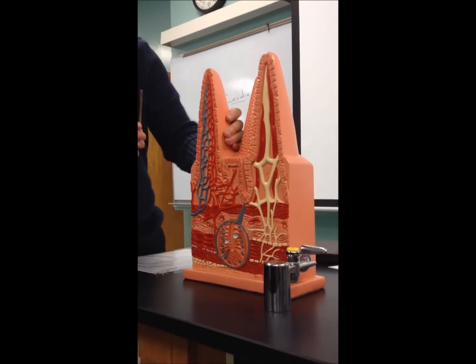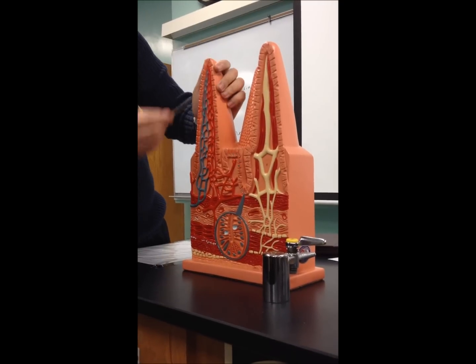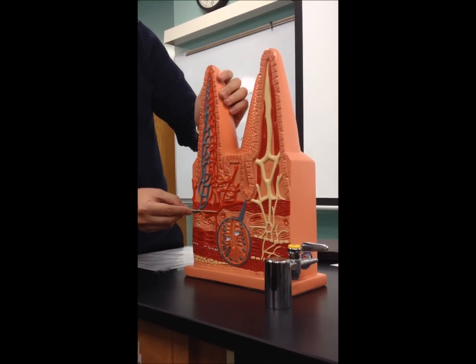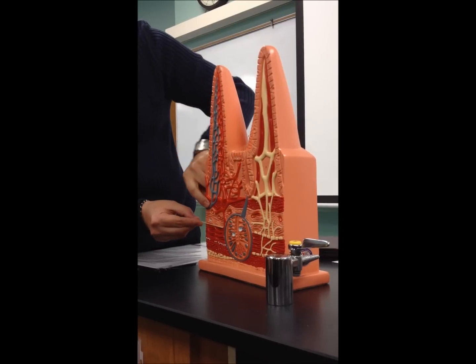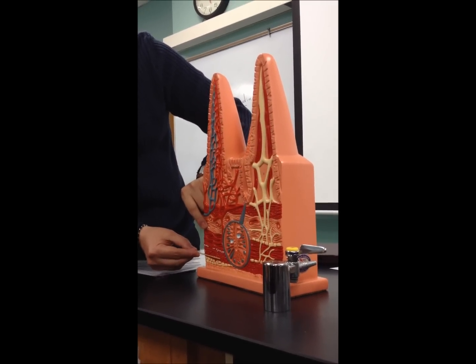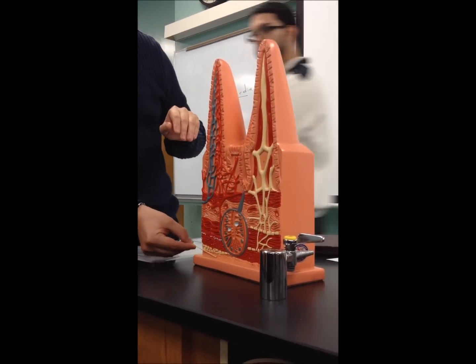I just want to make sure that we understand where the borders between things are. From here down to here, this is going to be mucosa, all the way up. From here to here, this is submucosa. This is the muscle layer, muscularis externa, and this is going to be the serosa.